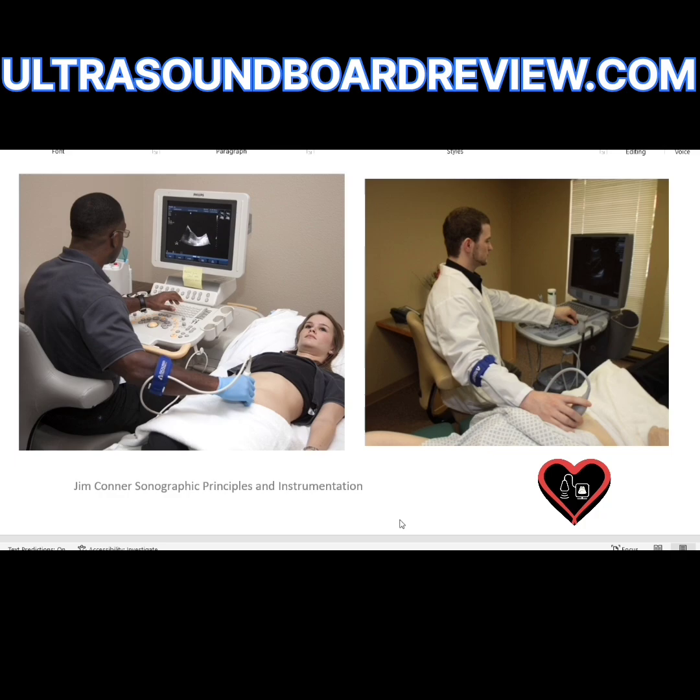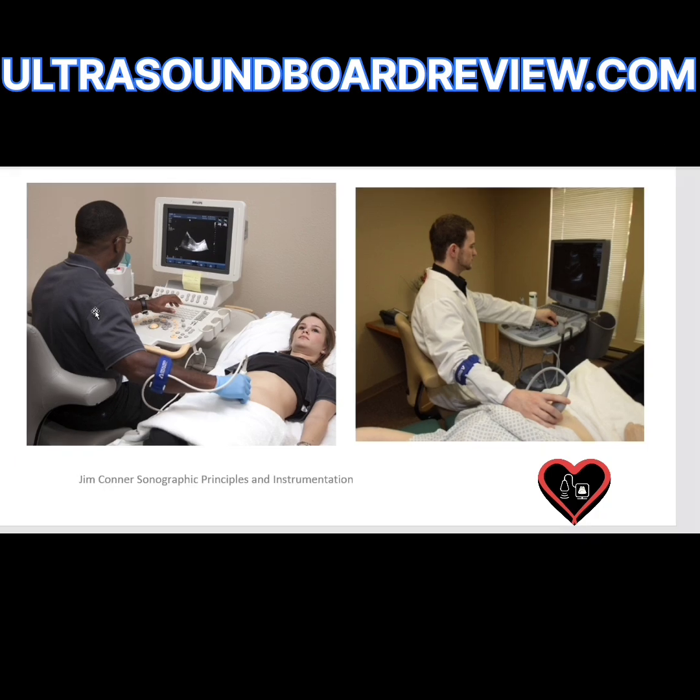What's wrong with this image? This is almost perfect. The only thing I would fix is his upper back is hunched over and he's kind of looking down at the monitor — everything else looks fine. It looks like he's scanning in the neutral position. If he would just bring the monitor up — raise the monitor or lower the chair. What about this one? Bring the monitor closer to the sonographer because it looks like he's stretched out too much. Look how easily he can grasp the buttons, yet he's all the way stretched out and could barely reach other buttons.